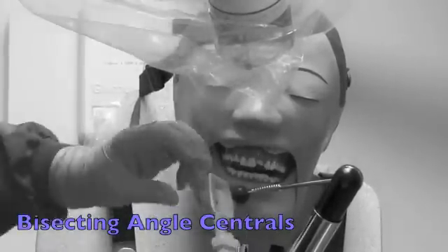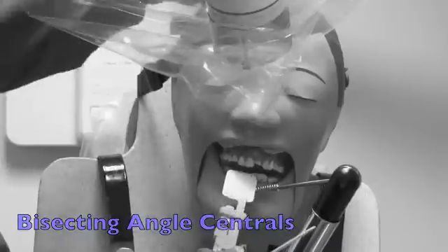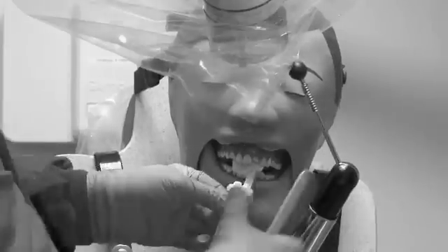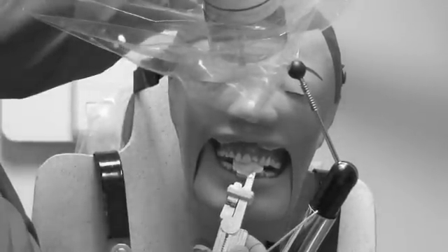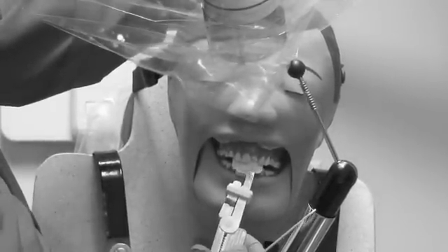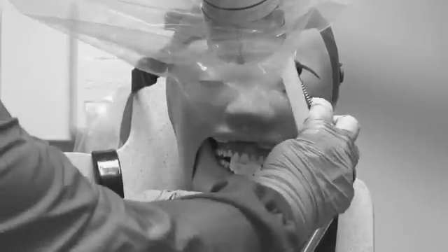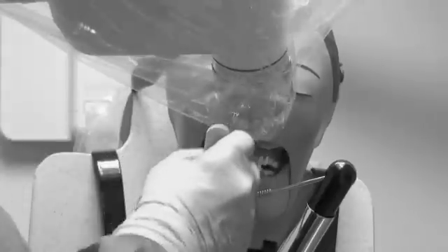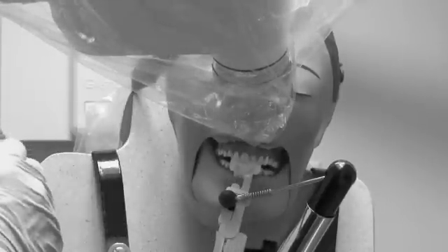For the central view, put the film dot in the holder. We're going to place it in the mouth right against the palate, making our own one-eighth to a quarter inch border. Have the patient bite down and hold it with their finger against the palate. Line this up using our tongue blade, lining up with the bottom of the holder, then check the bottom to be sure that it is all covered so you won't cone cut.